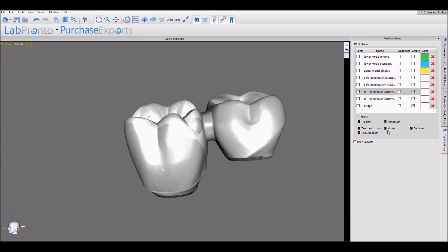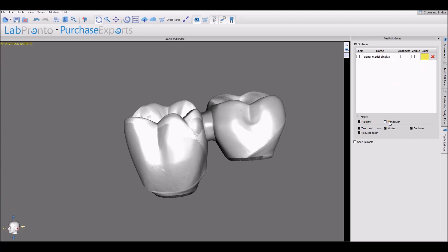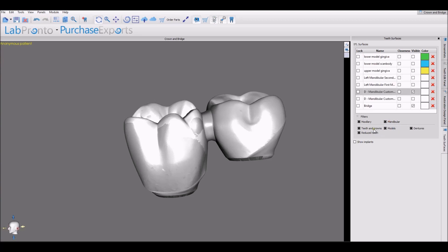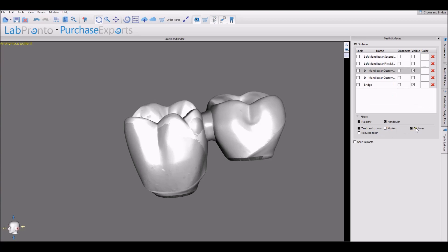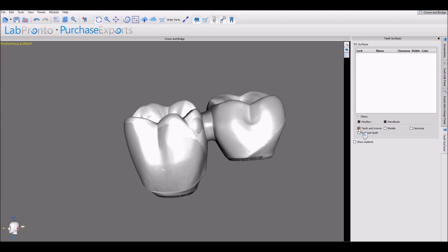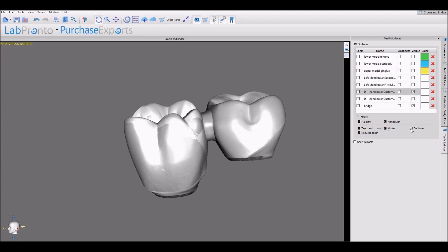Just a word about the filters we have here. As the number of surfaces increases, you can take advantage of the different filter options. For example, if you only want to see the surfaces connected to the lower arch, then just uncheck Maxillary, or vice versa. If you want to see just the teeth and crowns, then you could uncheck the models and those are removed. You have different filter options here — you're not deleting anything, you're just hiding it from the list that appears in the surface panel.